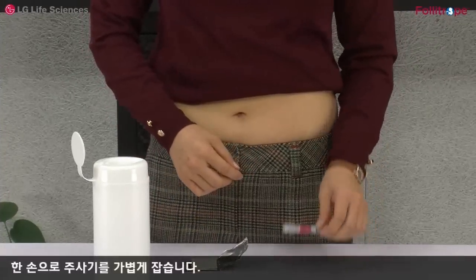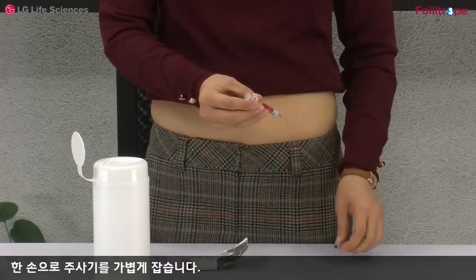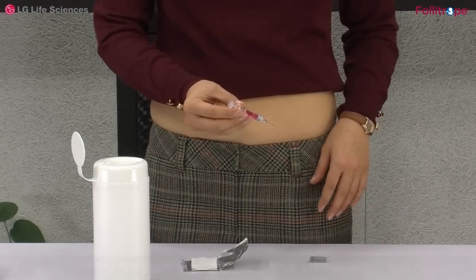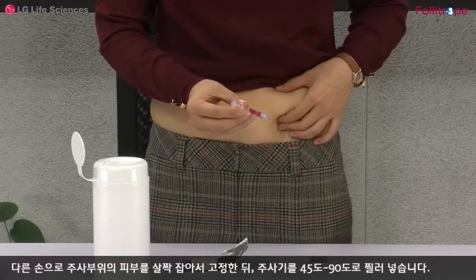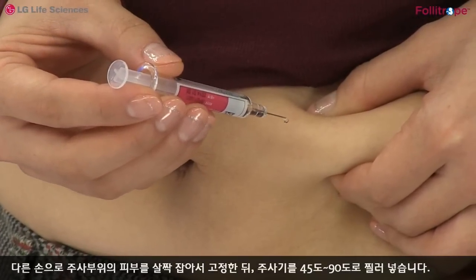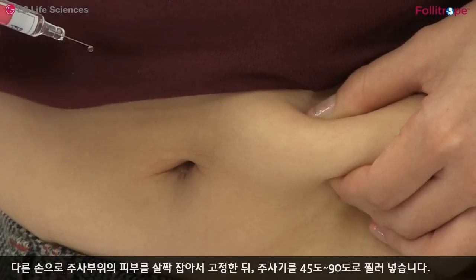한 손으로 주사기를 가볍게 잡습니다. 다른 손으로 주사 부위의 피부를 살짝 잡아서 고정한 뒤 주사기를 45도에서 90도로 찔러넣습니다.